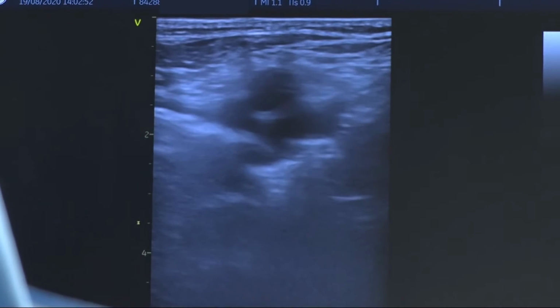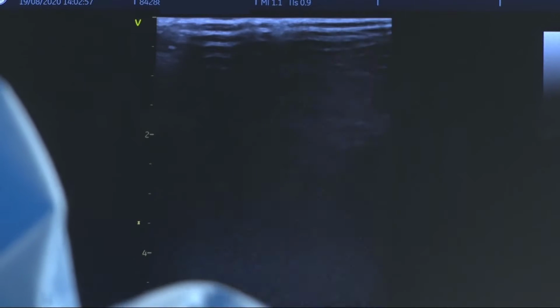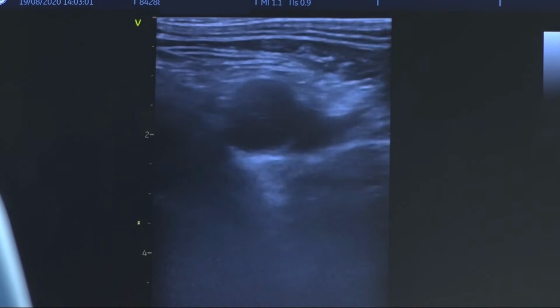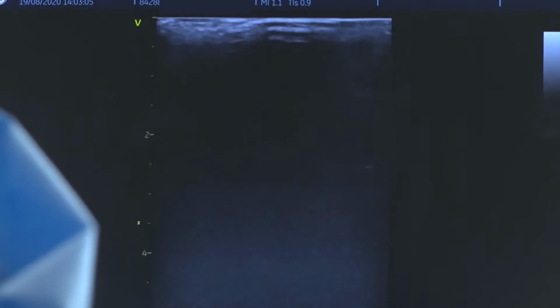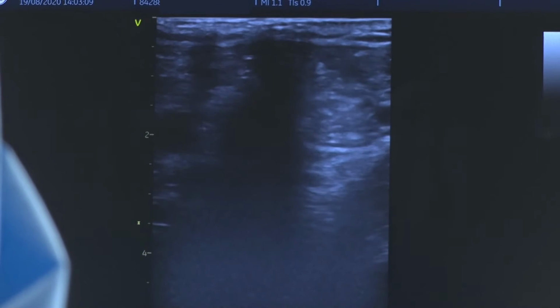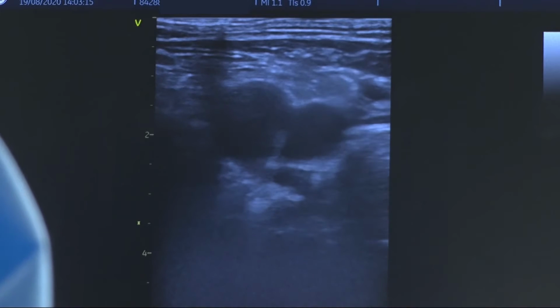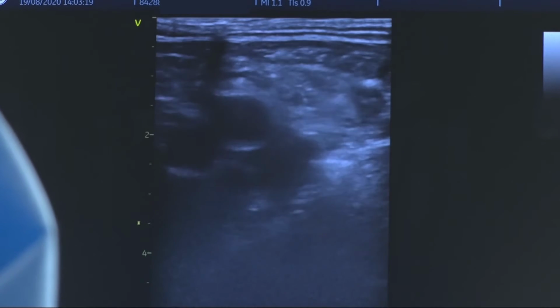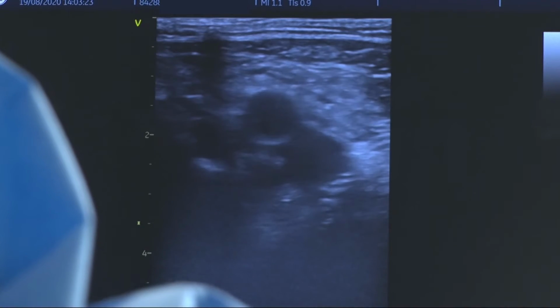femoral vein puncture, and you can differentiate which one is the femoral artery and which one is the femoral vein by compressing the patient's groin area with the probe. If it is compressible, that is definitely the femoral vein. So try to inject local anesthesia and insert the puncture needle directing to the femoral vein.